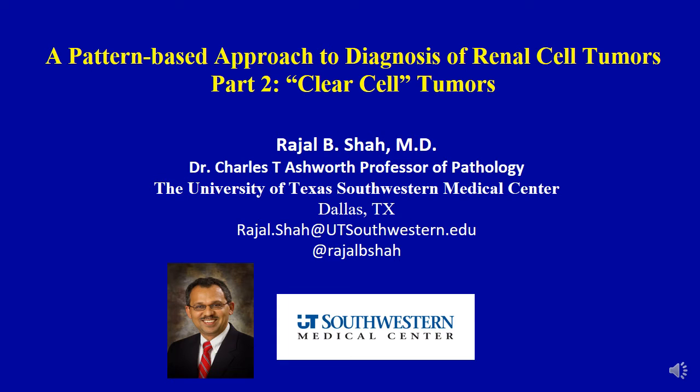Hello everybody, this is Dr. Rajal Shah, continuing on the theme of a pattern-based approach to diagnosis of renal cell tumors. This is the second video, which is going to focus on clear cell tumors.